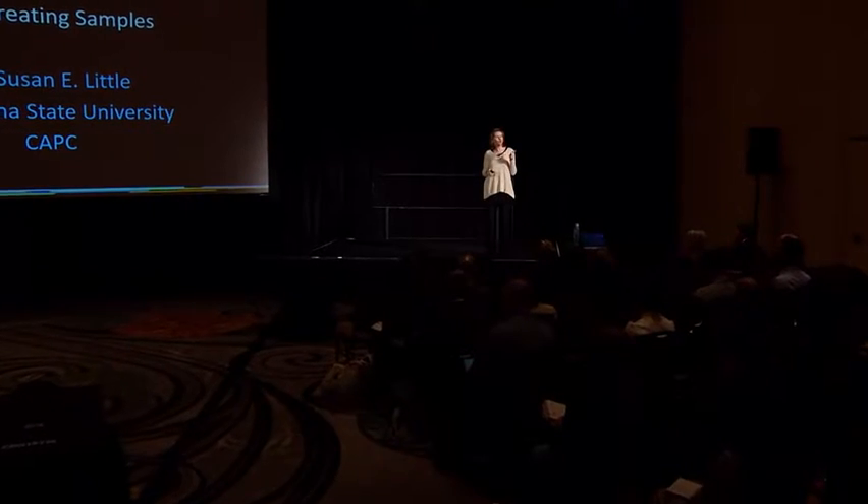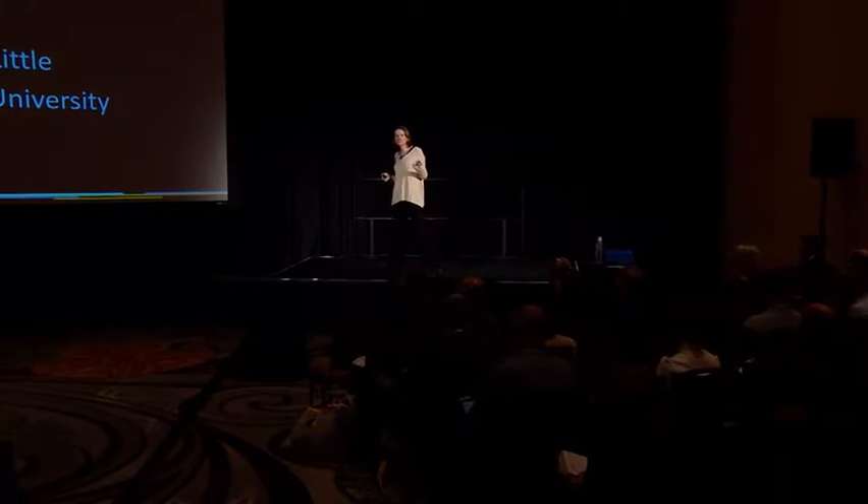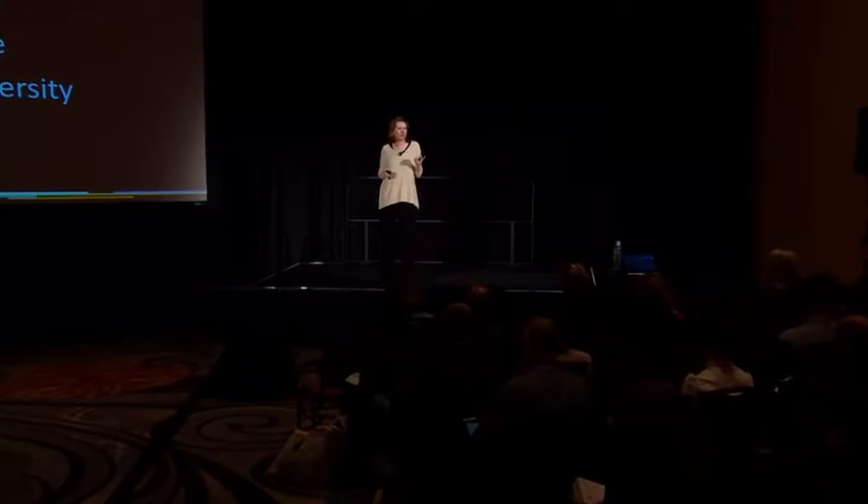I want to share some data accumulated over the last few years about heartworm testing and a phenomenon that's been rediscovered in the last three or four years, referred to as heat treating or pre-treating samples. When we test for heartworm, we use blood, plasma, or serum on an antigen test to detect antigens from adult female worms, letting us know that a dog is likely infected and needs additional diagnostic workup and potential treatment.